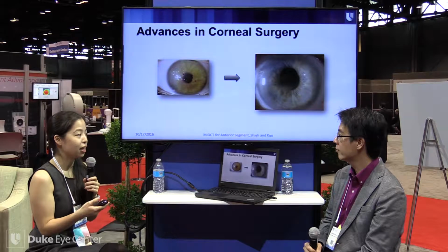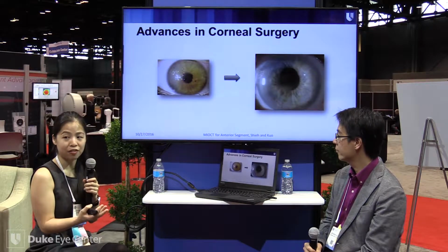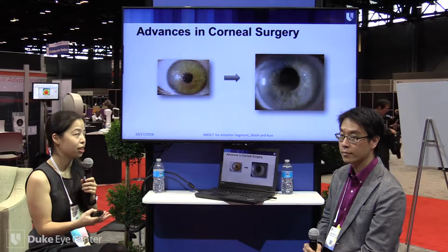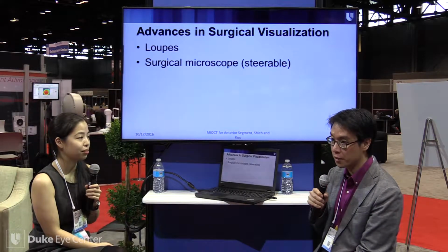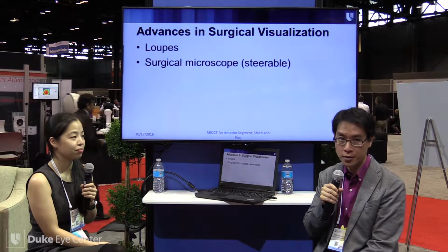Accompanying these increasingly sophisticated surgical techniques has also been technological advances, which allow the surgeon to refine and potentially improve the way that they perform anterior segment surgery through OCT. Dr. Ko? So in contrast to the advances that have been made in the surgical techniques, the surgical visualization has not really advanced very much at all.